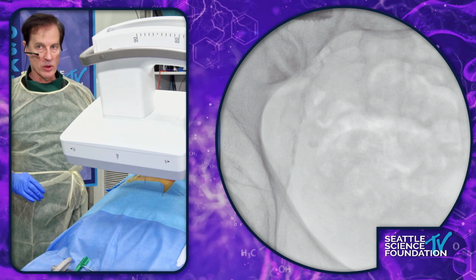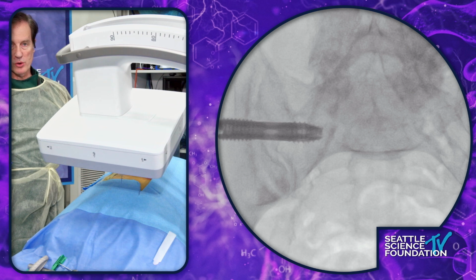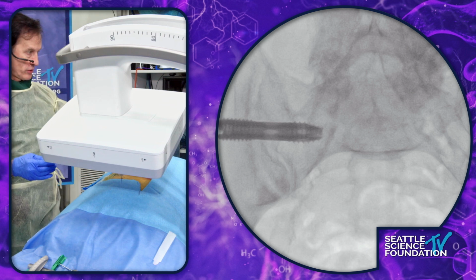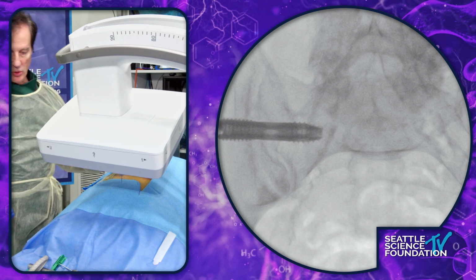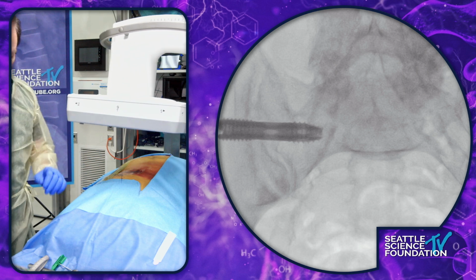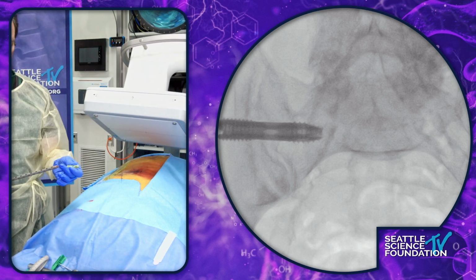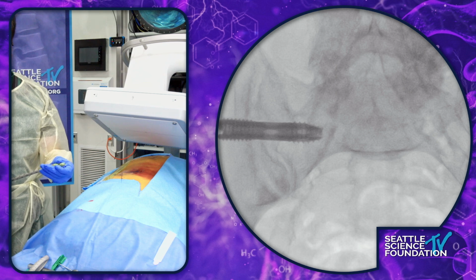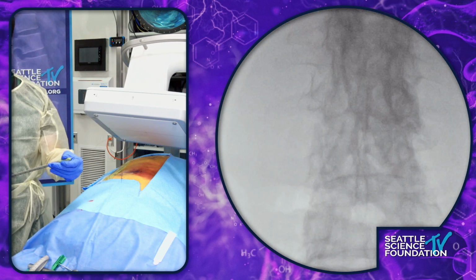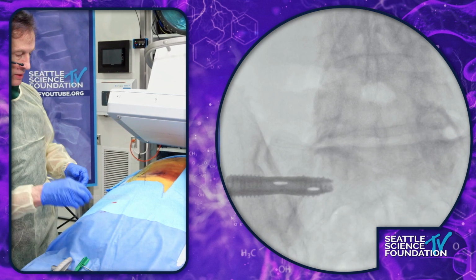I'm going to go ahead and we will show you the posterolateral approach. And this is something that is, so let's come back to the outlet view. And then we'll look at both of these implants on the lateral view. And I've kind of arbitrarily selected a shorter implant for the posterolateral view to try to get around the lateral implant that's existing already in there. So we'll start out again with the Steinman pin.